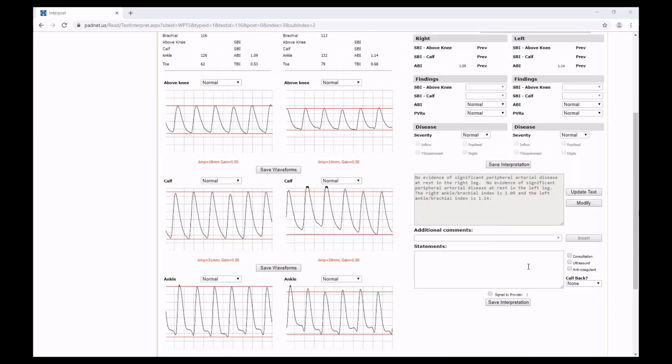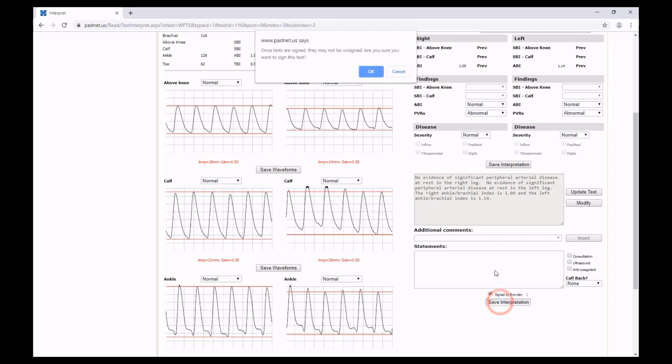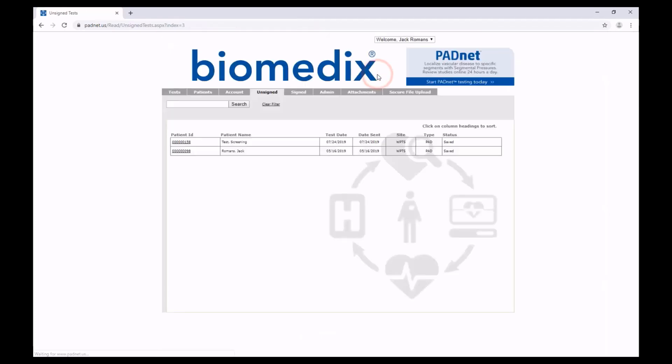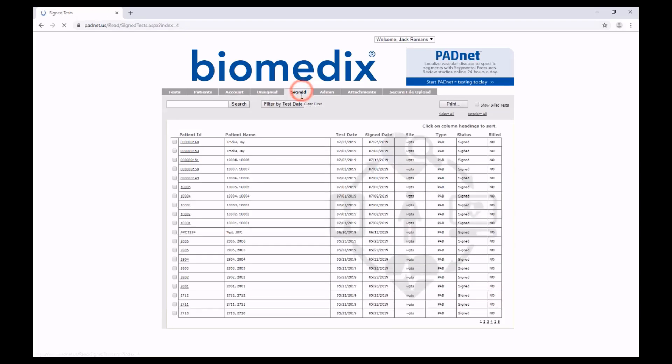So once we're happy with our interpretation, we can save it and click the Signed by Provider button. Again, you'll see once tests are signed, they may not be unsigned. If you're happy with this, you click OK. And your test moves from the Unsigned to the Signed tab, along with all other signed tests.